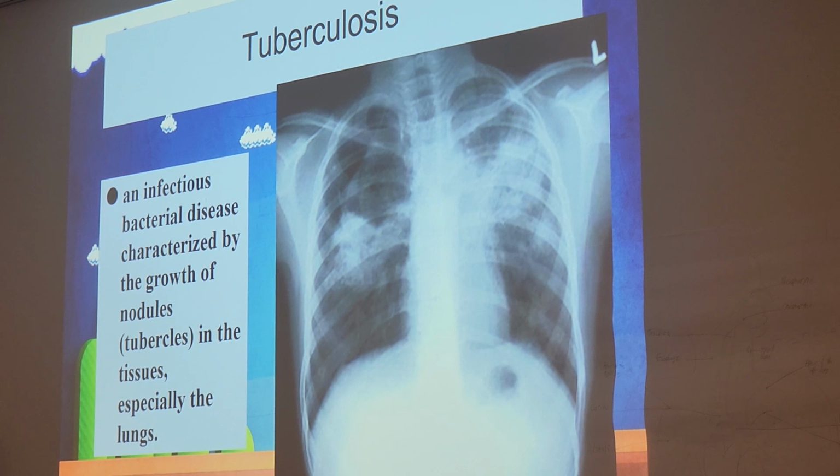So, just one thing to keep in mind, identify it on an x-ray as well, guys, not only for your test, but for your own safety. You may not know a patient has tuberculosis, but then you take an x-ray, you see something that looks like that. What's going to be your immediate action if you see an x-ray that looks like this and they didn't tell you the patient had TB? Yell at the nurse. Get out. Get away. Well, of course, you're going to disinfect.